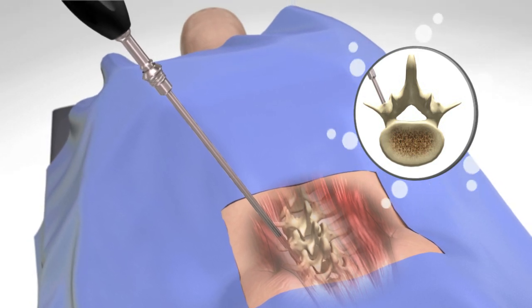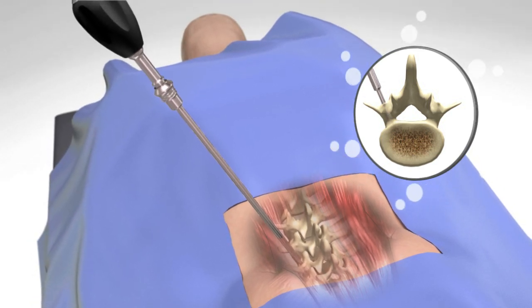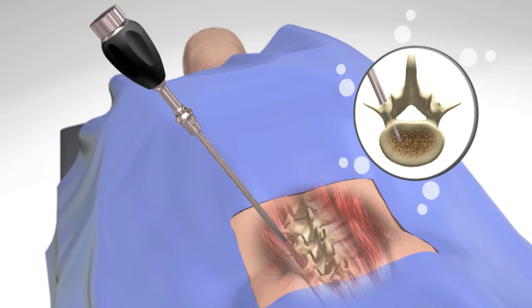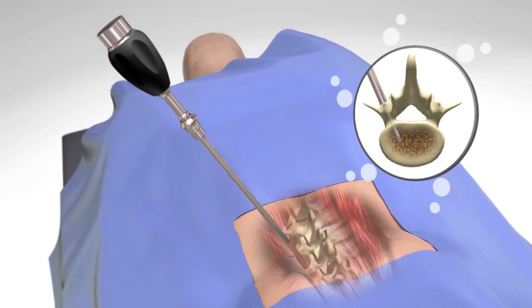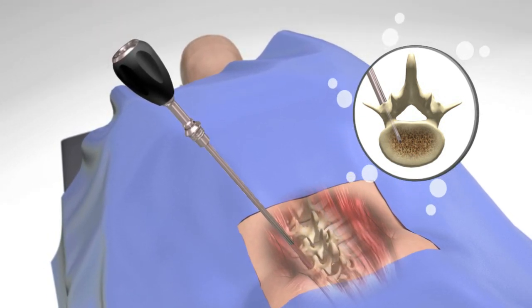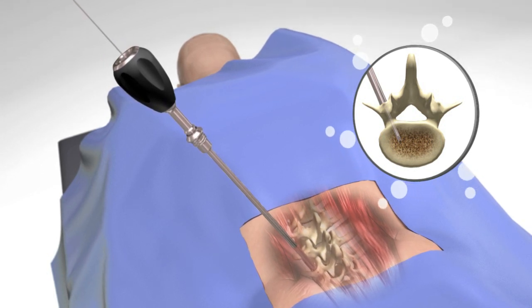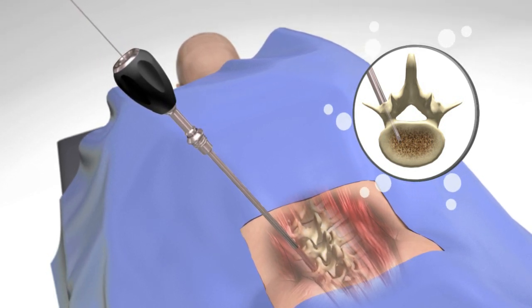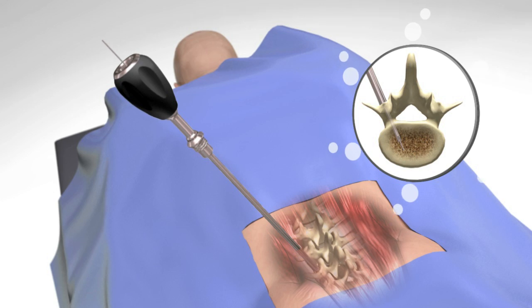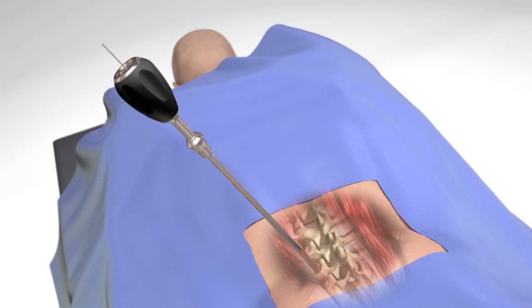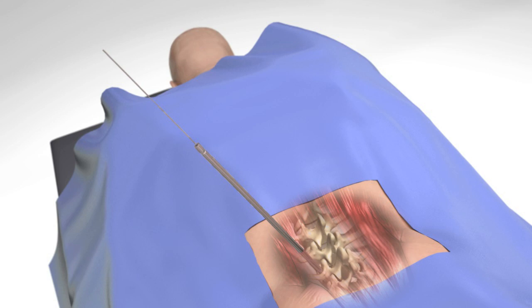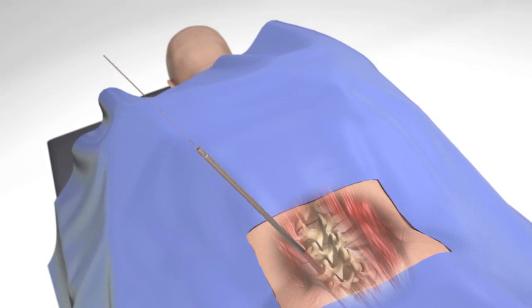Continue to advance the cannulated awl under fluoro. Keeping the cannulated awl in place, remove the inner stylet and advance the guide wire. Remove the handle, leaving the awl shaft in place to act as the first dilator.